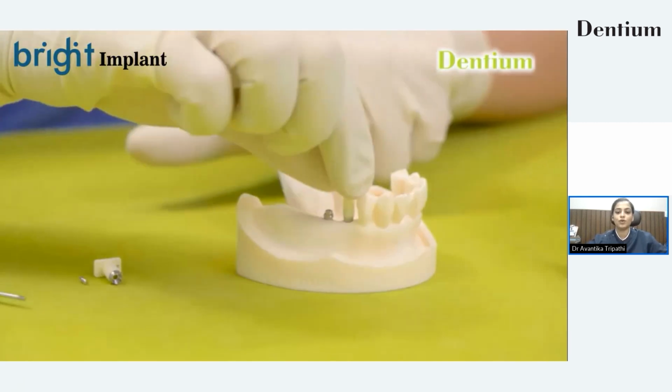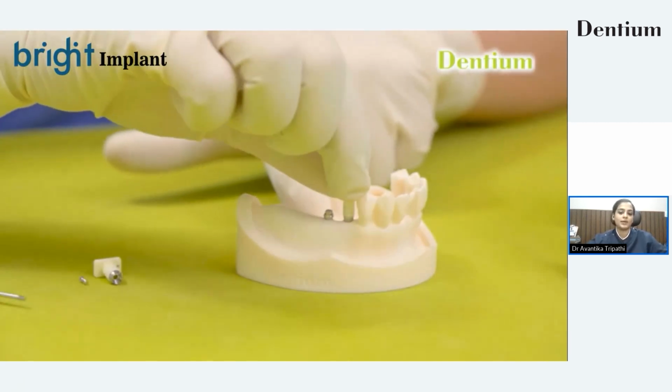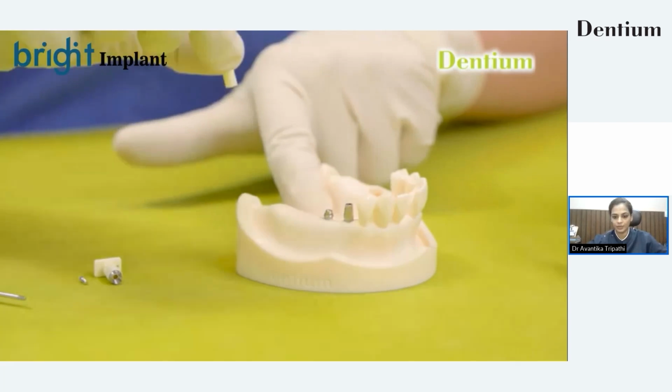Once the delivery holder is removed, then I am going to scan my digital abutment. So now it is ready to scan.